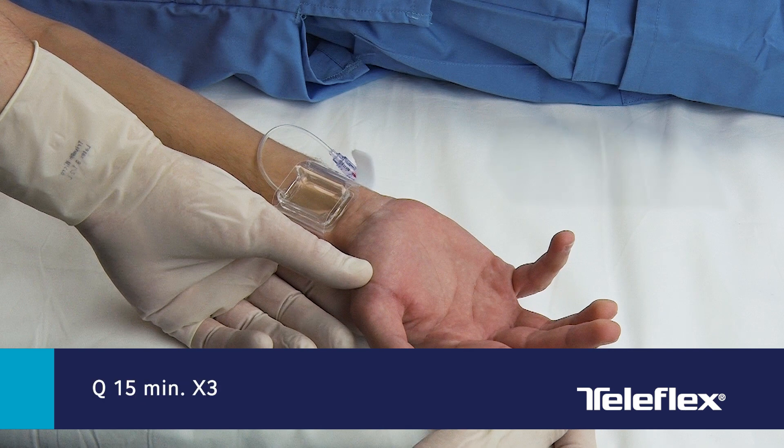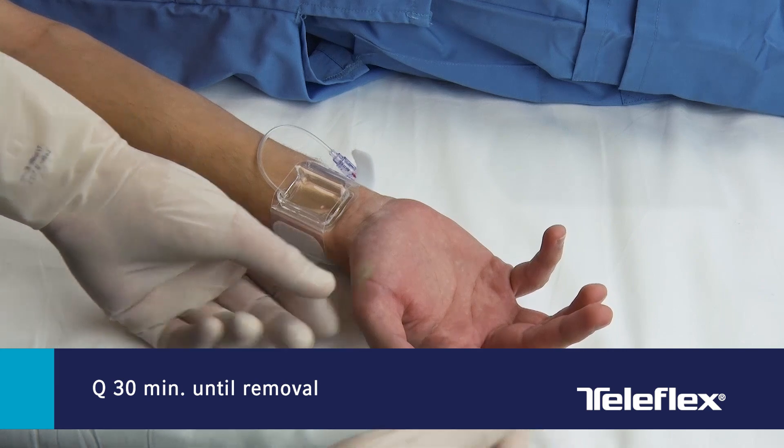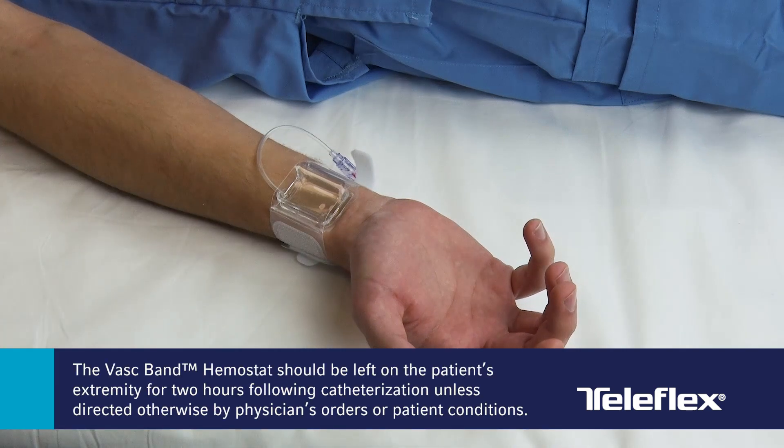After the first 15 minutes, record vital signs and assess perfusion every 15 minutes for 3 times, and then every 30 minutes until initiating device removal. The VASC-Band hemostat should be left on the patient's extremity for 2 hours following catheterization, unless directed otherwise by a physician's orders or patient conditions.